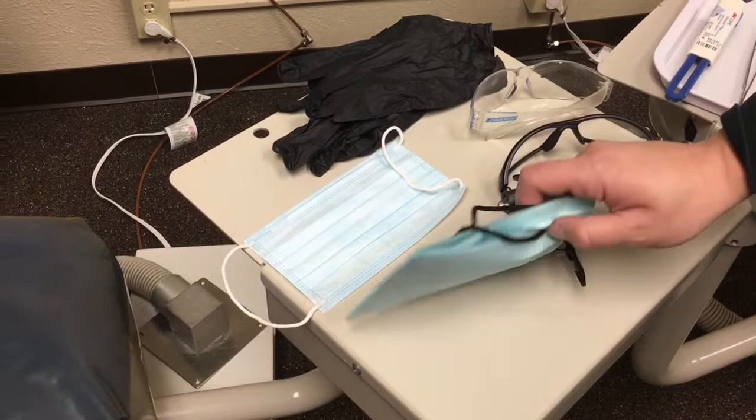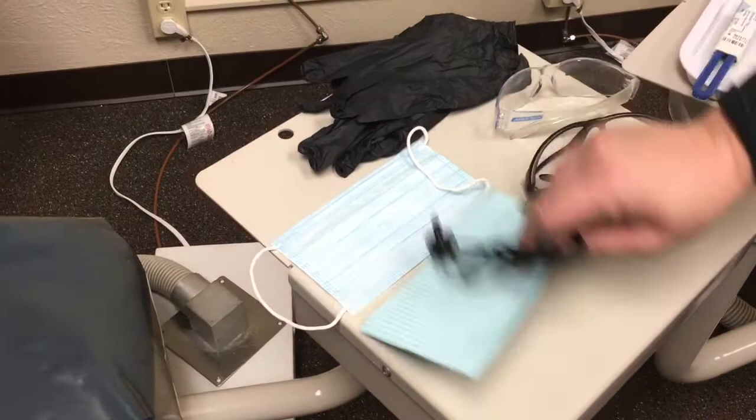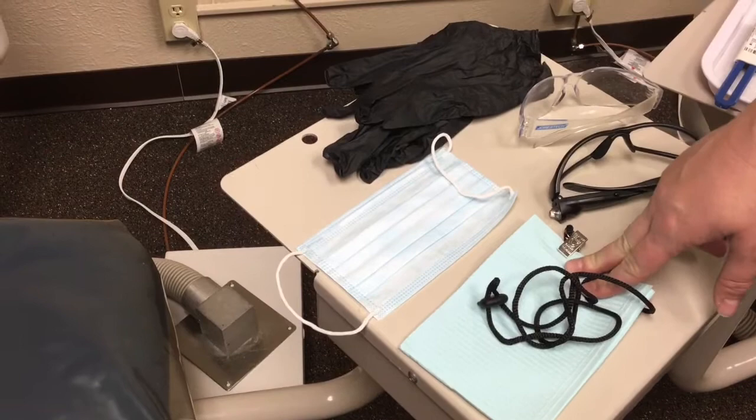After you set the whole tray up, it's always advised that you cover up the tray with your patient bib just to ease the patient's anxiety of seeing any of those scary instruments that are about to go into their mouth.